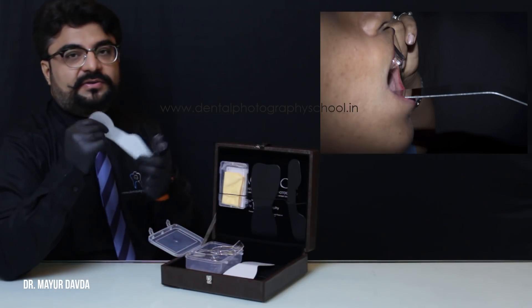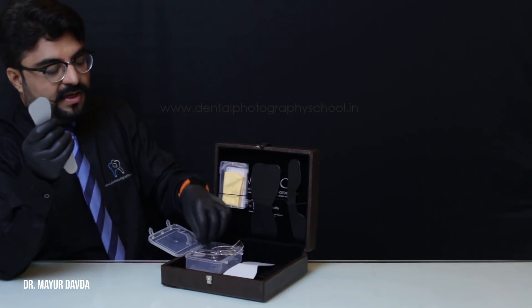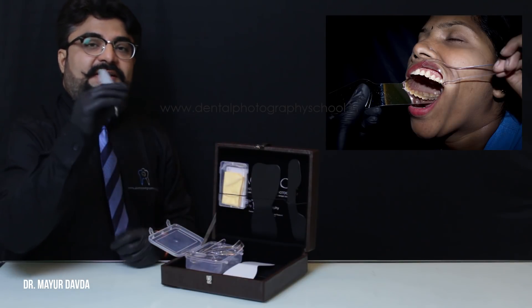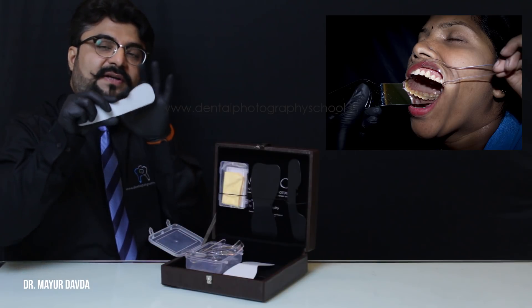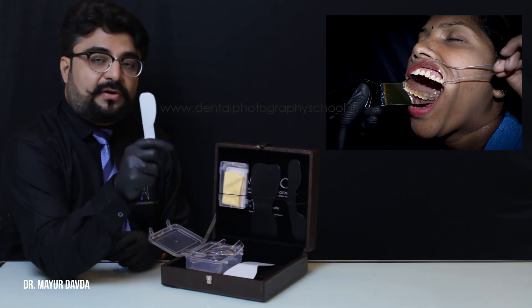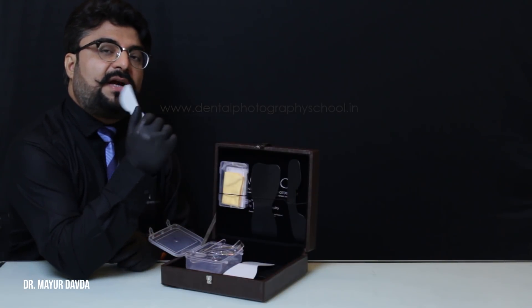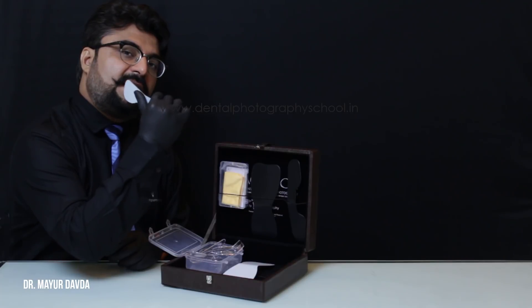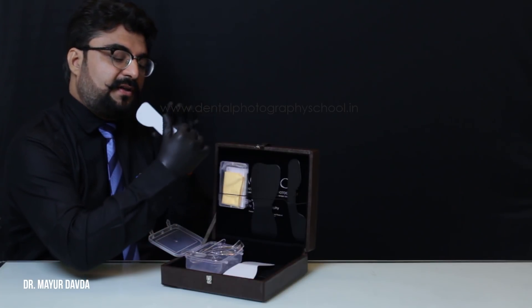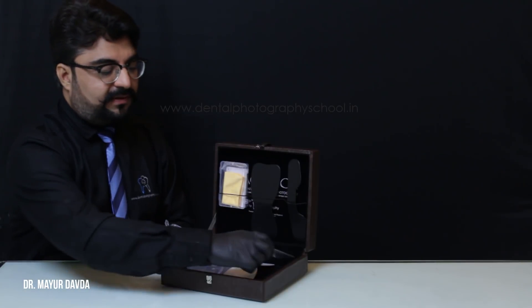The concave aspect is used mostly in periodontal cases — this is the periodontal side of the mirror. It goes easily inside the mouth; the convexity can go inside the palate and the periodontist can record the palatal flap. Or if you want to record the lingual flap on the mandibular arch, it goes inside the floor, retracts the tongue, and you can get the lingual flaps very nicely.